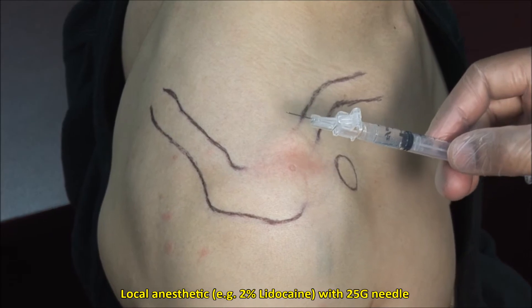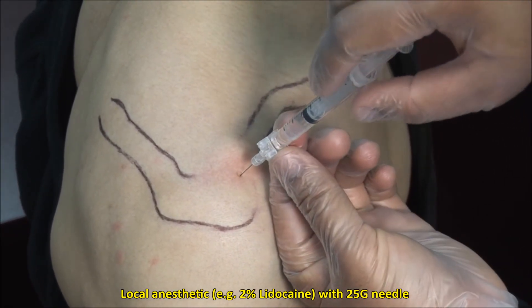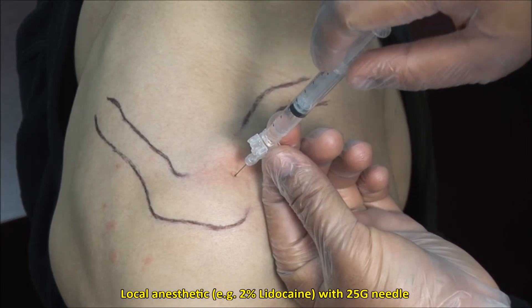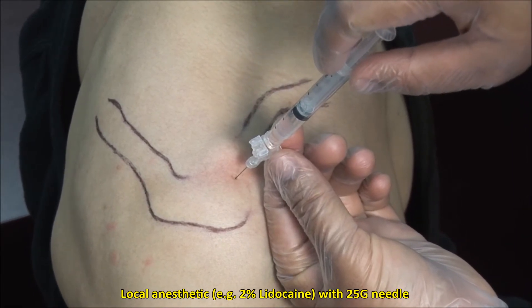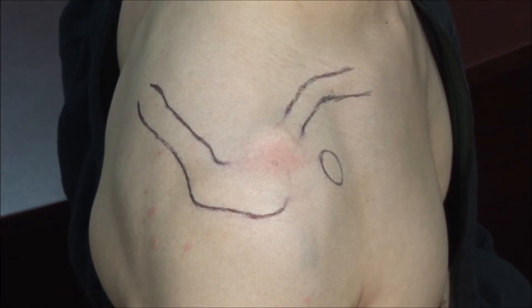Local anesthetic can be applied to the skin and subcutaneous tissue using a 25 gauge needle, but this may be bypassed as infiltration of the anesthetic may be just as painful and would mean two needle sticks for the patient.